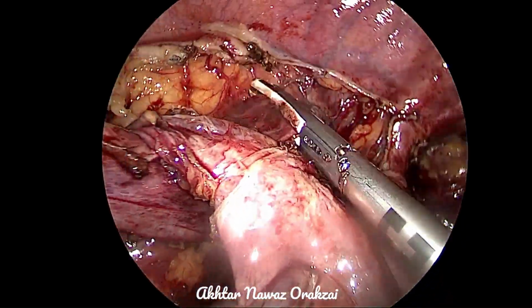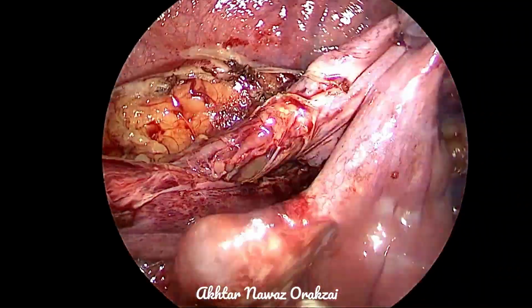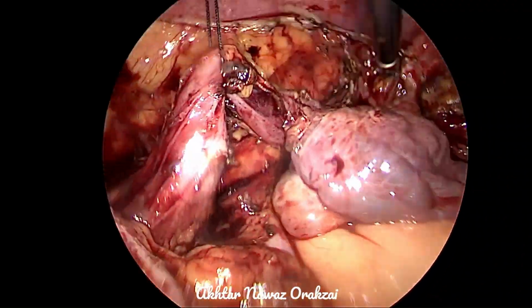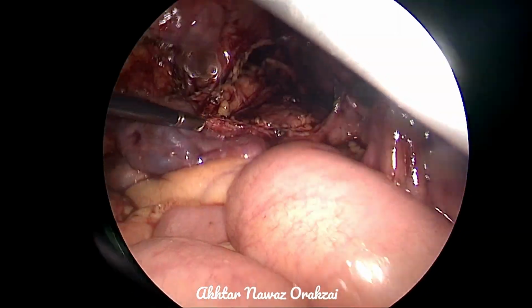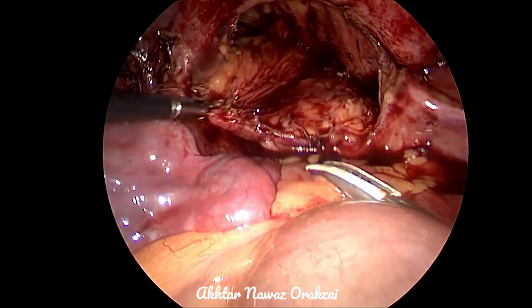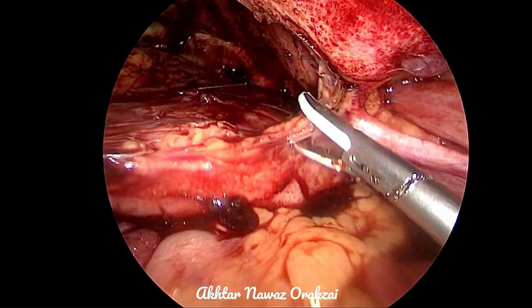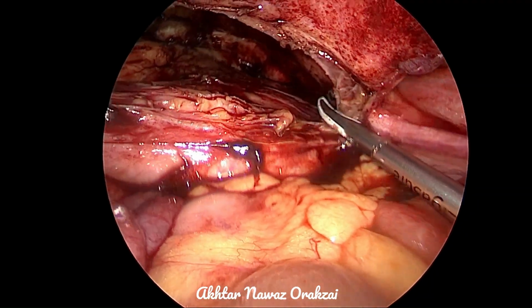This last bit of fibrotic tissue is being coagulated and cut. Now you can see that it can be beautifully lifted up. And pulling the bladder towards the psoas muscle will point us to the limiting factor, which is effective against the mobilization. So that limiting factor is identified and then mobilized.